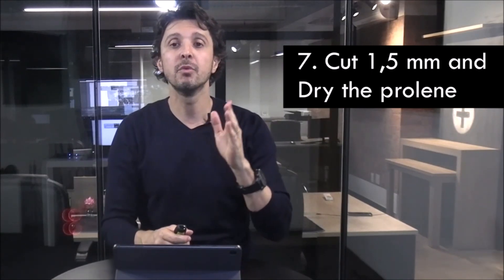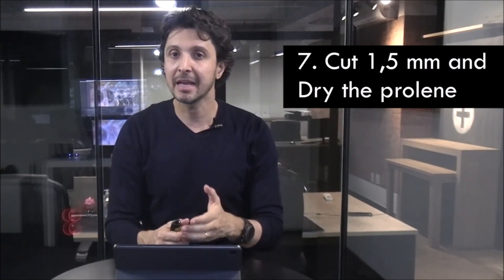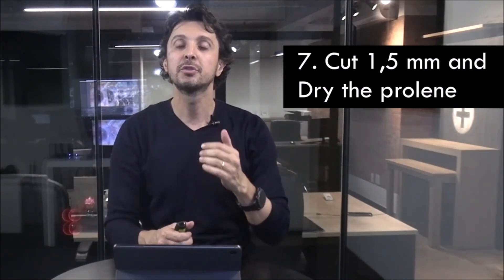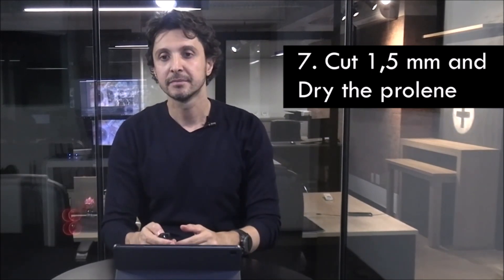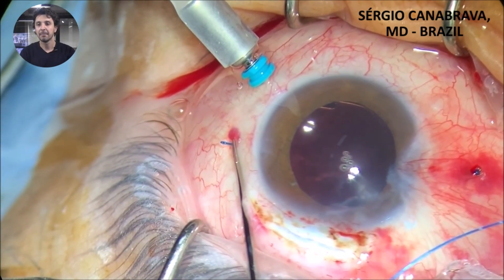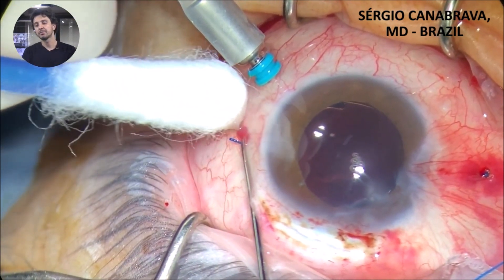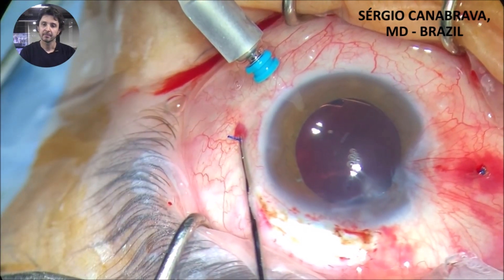Tip 7: cut about 1.2 to 1.5 mm from the base of the polypropylene and the sclera. This is a good size to create the flange and a good size to insert the flange inside the sclera, to avoid tilt and to avoid a big flange outside of the eye. Observe in the video how I cut it about 1.2 to 1.5 mm from the base of the polypropylene, and how I dry it with cotton to facilitate the flange.